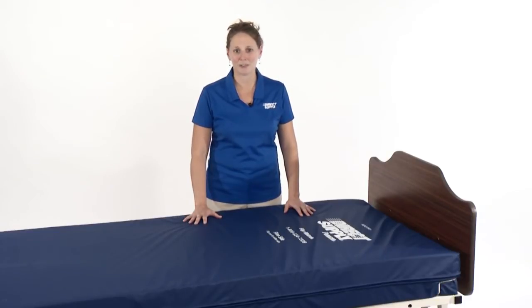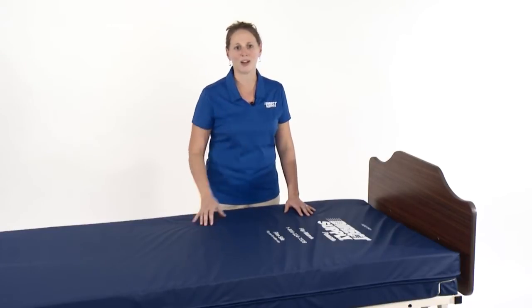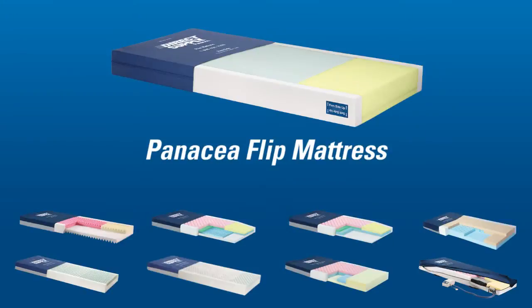Plus, the Panacea Flip Mattress is guaranteed with our five-year warranty and we'll even let you try one for free. The Panacea Flip Mattress is new to our line this year and we're excited to announce that it's patent pending.